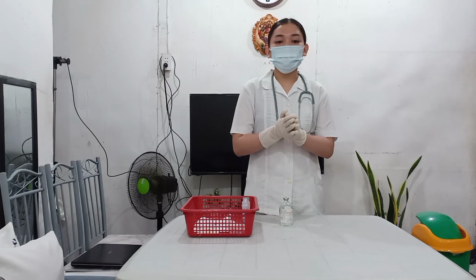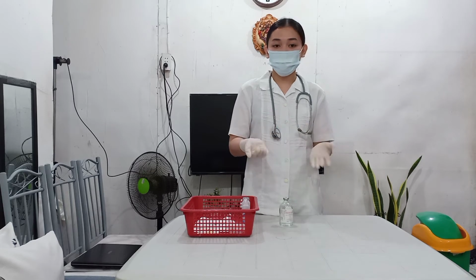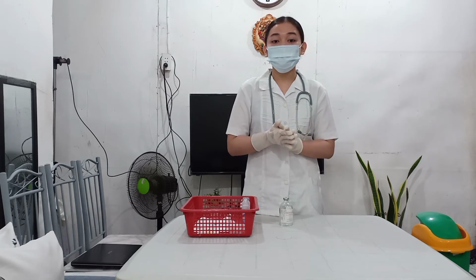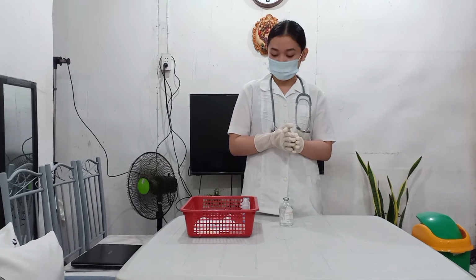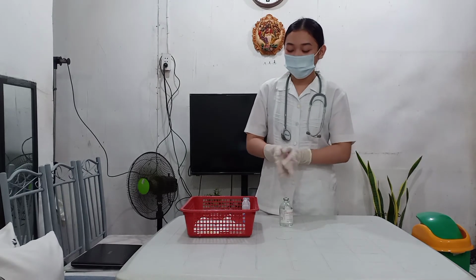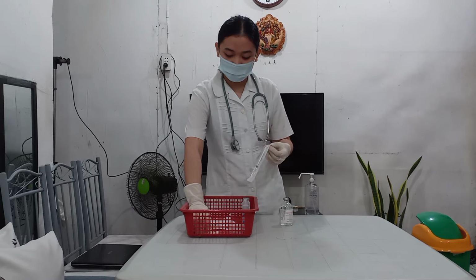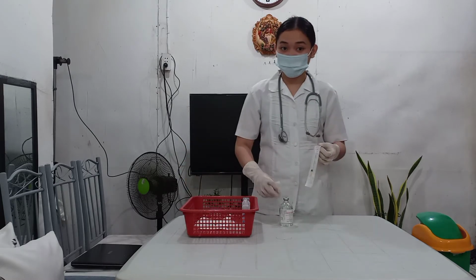Now we attach a filter needle to draw up pre-mixed liquid medications from multi-dose vials. Filter needles prevent the inadvertent administration of small glass fragments when drawing up medications from a glass vial. So while waiting for the antiseptic wipe to dry, I am going to attach the filter needle or the withdrawing needle.